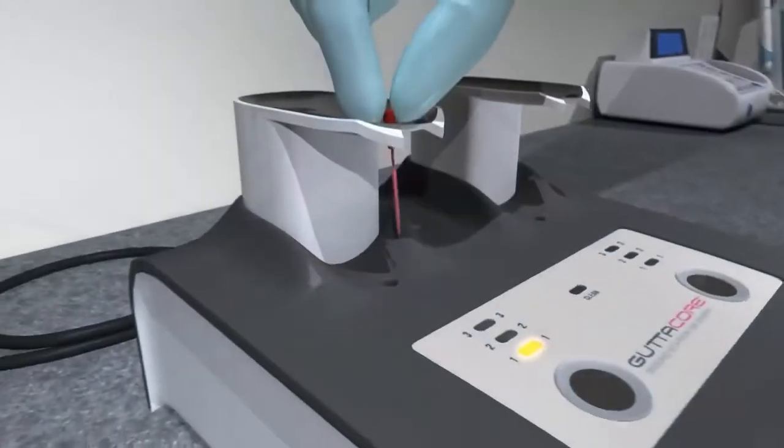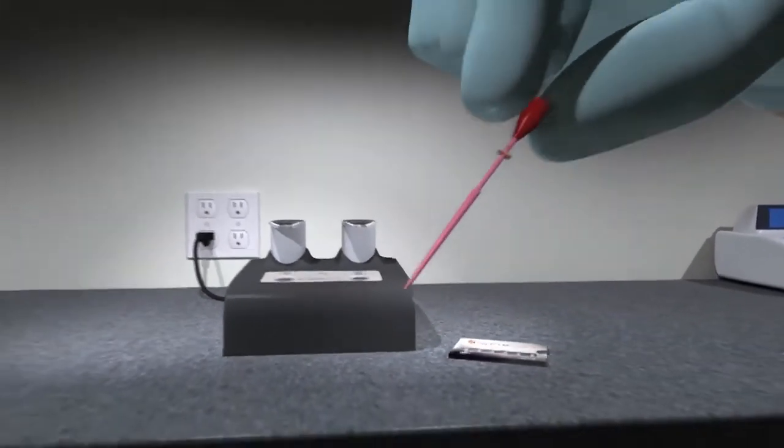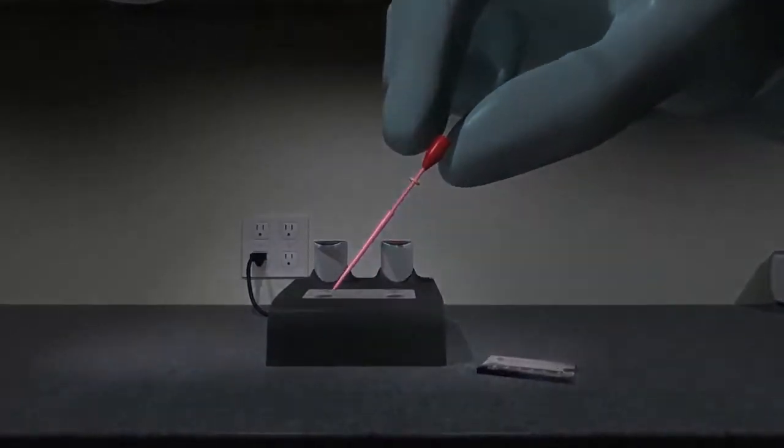Gutta-core obturators are coated with the same flowable alpha-phase gutta-percha that's provided predictable fills for more than 20 years. But gutta-core is changing obturation from the inside out.